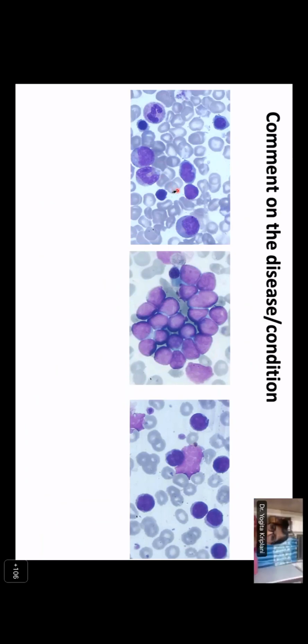Leukoerythroblastic picture showing immature WBCs and nucleated RBCs. This is a marrow. Why do you say leukoerythroblast? Sorry sir, this is marrow. Normoblast. Okay. And do you see any blast cells? What about this? Sir, these are lymphoblasts, sir. Okay. And what about these two cells?